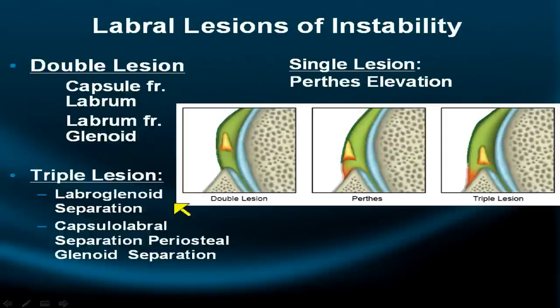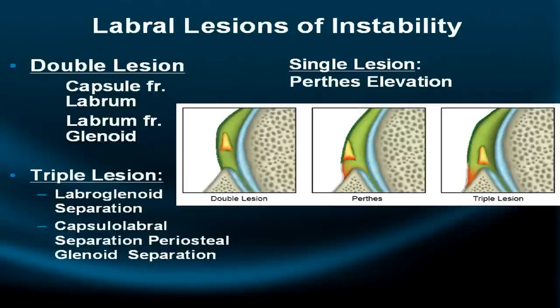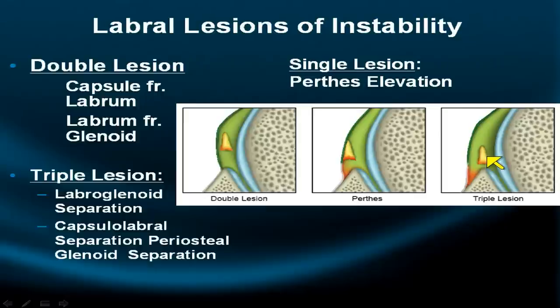In the double lesion, the labrum has separated from the underlying glenoid, and there is also separation of the capsule from the labrum — two abnormalities, hence the designation double lesion. In a triple lesion, there is labroglenoid separation, capsulolabral separation, and periosteal separation at the base — three processes occurring simultaneously, thus the designation triple lesion.